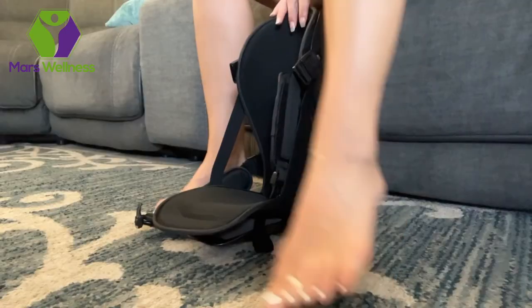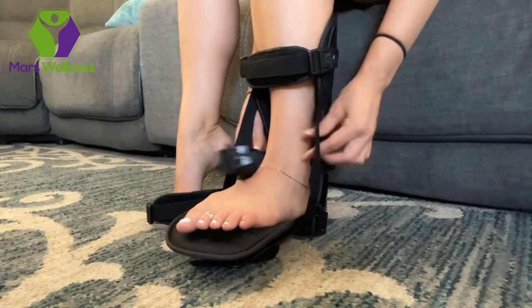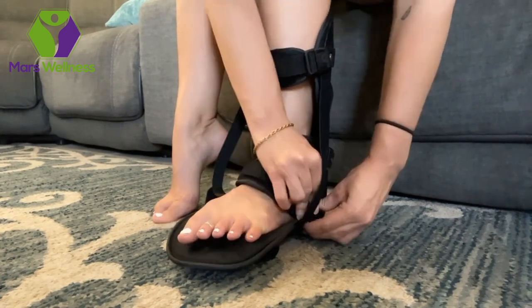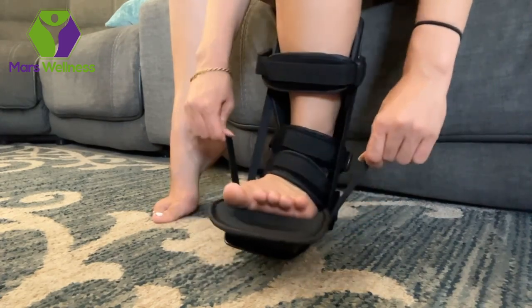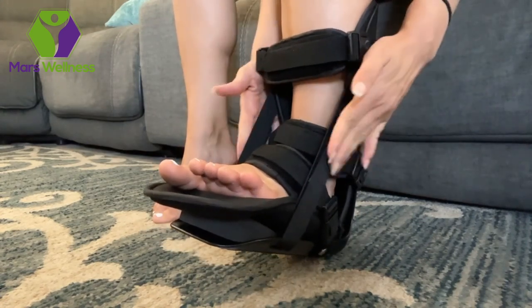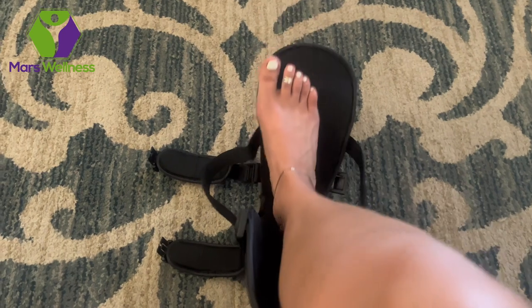Unbuckle all the straps and put your foot in, then re-buckle all three straps. Each strap is padded and adjustable. A unique feature about this night splint is that it has buckles on both sides of the straps — this eliminates the need to reach over and buckle the splint. Then adjust the velcro straps as needed.